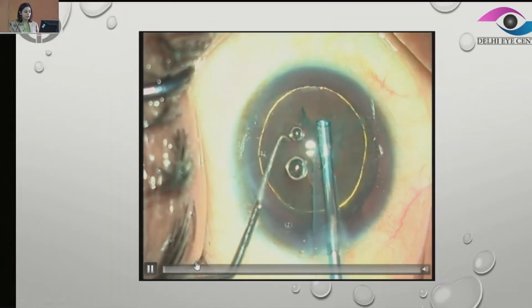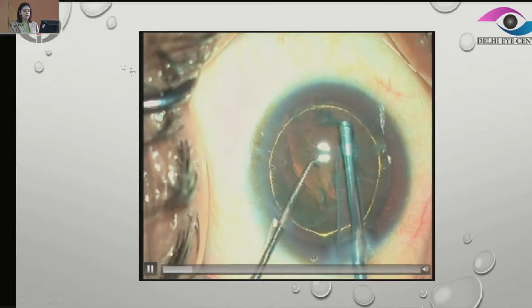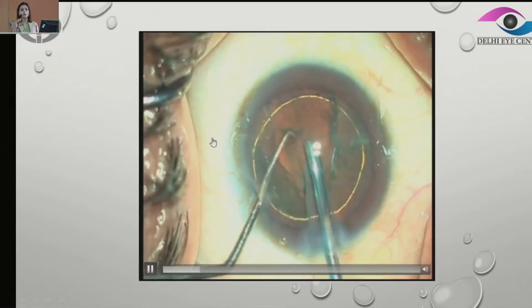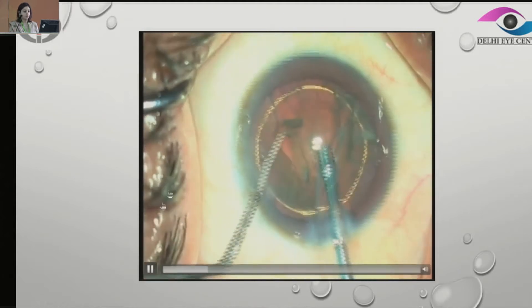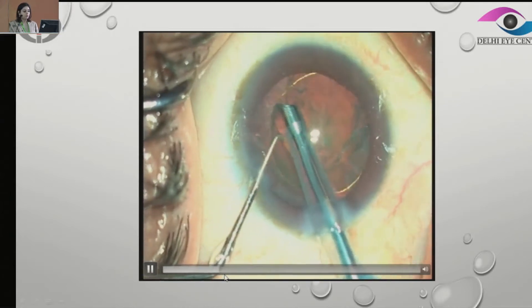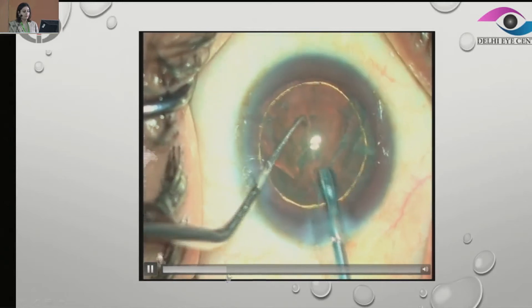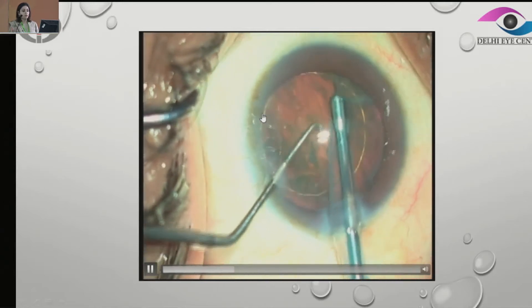Now this is another case. One of the tips is that we do a good hydro-delineation, and then again we are going to go ahead and remove all the loose epinuclear plate along with the anterior epinuclear plate, and again free the nucleus throughout and rotate it.